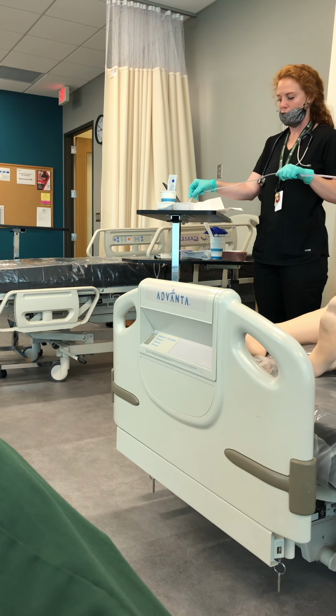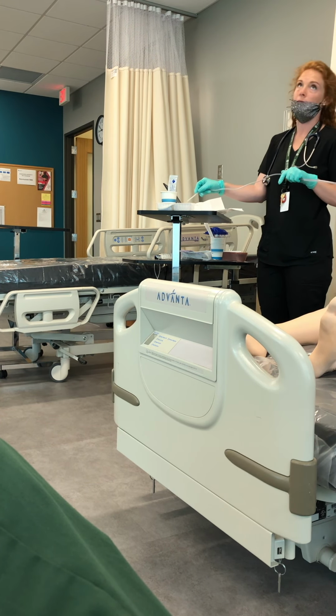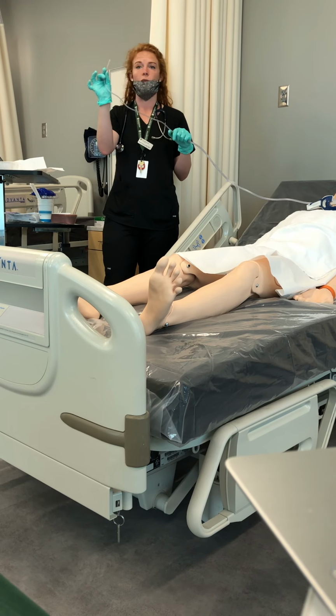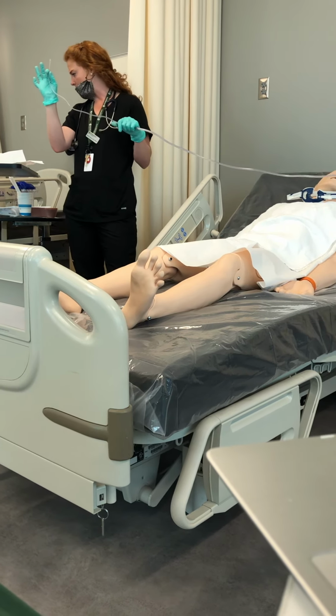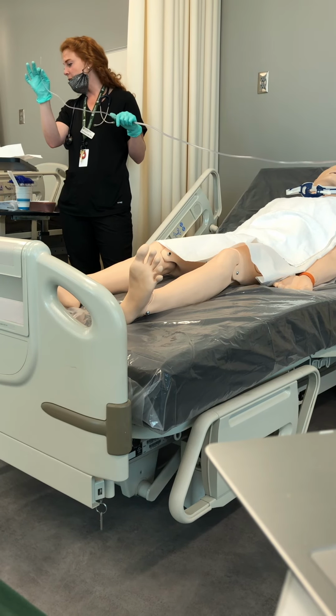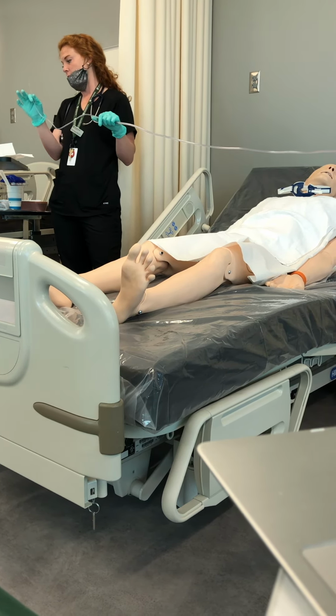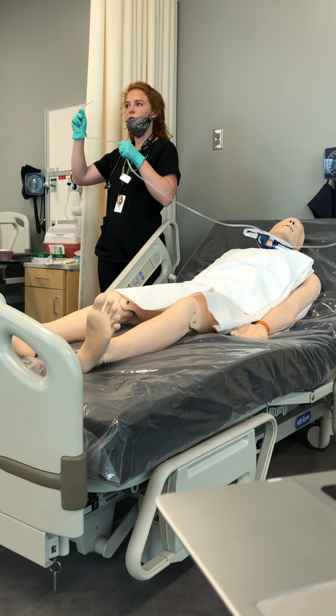And then you want to test it. You'll make sure that your suction's working, which unfortunately it's not, but we'll suspend reality and say that it is. So test the suction, and then hold the catheter between the dominant thumb and index finger, or however you feel most comfortable. But I do use my index finger. Then you're going to insert it through the tracheostomy until you meet resistance or until the patient coughs. Once you get there, for 10 to 15 seconds, you're going to apply suction intermittently, so it's just kind of in and out. And as you do that, you can twist the catheter and pull out slowly as you're twisting.